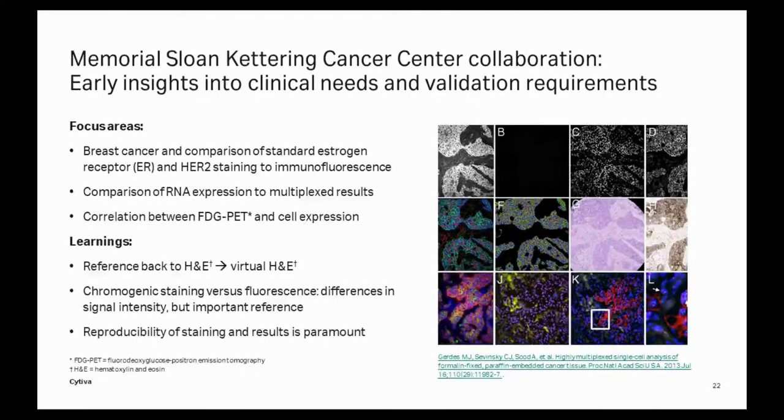Once we had some confidence in the performance of our antibodies and our workflows, we then started to get more complicated. They had some very nice RNA expression data sets that they wanted to compare our workflows to. That's another important point in any new technology, for those of you who are already working in this field: comparing back to the previous or earlier data and proving that you get either the same results, equivocal results, or new findings. But certainly step one is to prove that you compare to what's been done before, by an alternative method.